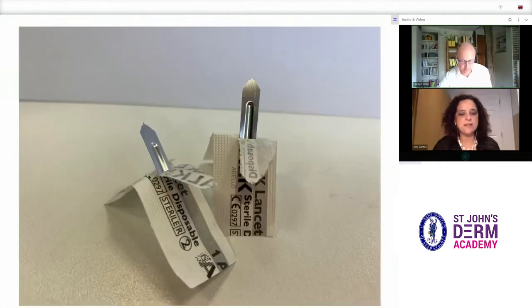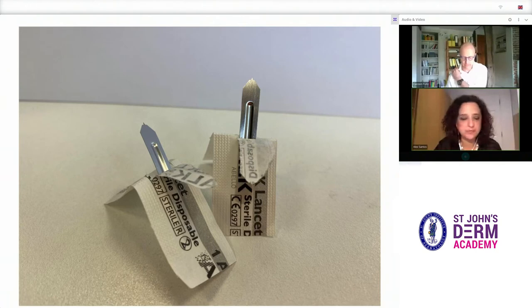This is a close-up of the calibrated one-millimetre lancet, which has a sharp tip. The idea is that the epidermis is pierced superficially, so the allergen is pricked into the dermis. Note that this should not hurt and should not draw blood either.